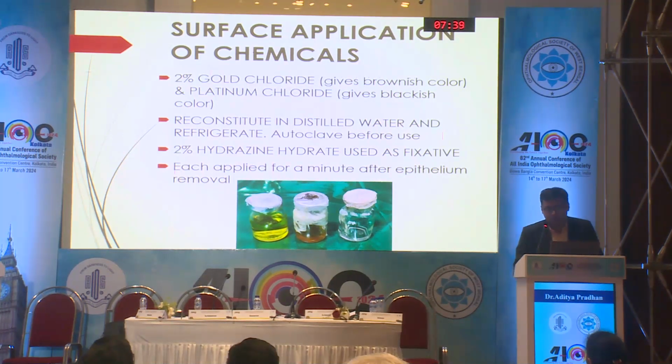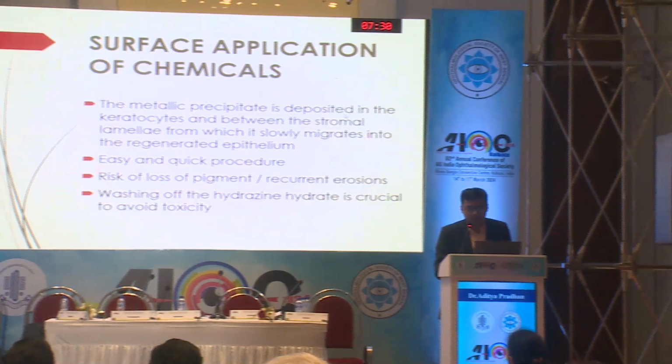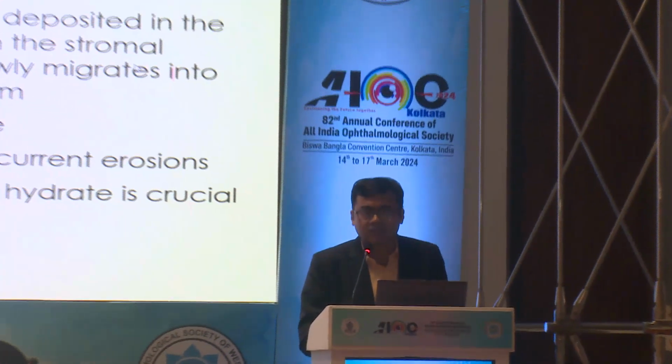Availability is always a concern, but this is definitely one of the methods you can use. So basically the precipitate, because of the reaction between the fixative, that is the hydrazine, and the salts, the metallic precipitate is deposited into the keratocytes and between the stromal lamellae, and it's an easy and quick procedure. But yes, definitely, as madam has mentioned before, they are irritant to the ocular surface and can lead to recurrent erosions. You have to wash off the fixative because it is very toxic to the ocular surface.